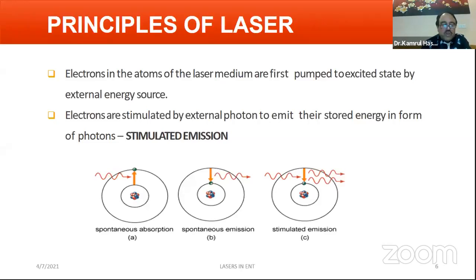Why are we talking about the laser? And what is the difference between the laser and our ordinary light? As Maiman first produced the laser. Ordinary light versus laser light. In our young child life, we have seen that the main light comes from the sun rays. And when we place a mirror and direct this light to paper, there is some burning of the paper. In this way, the thinking of laser comes.